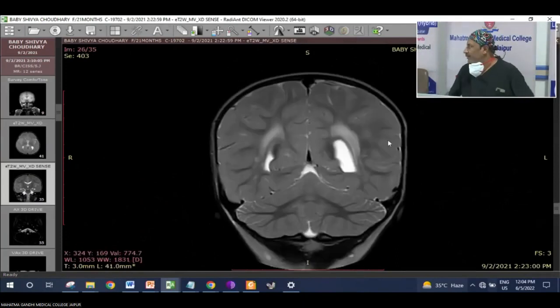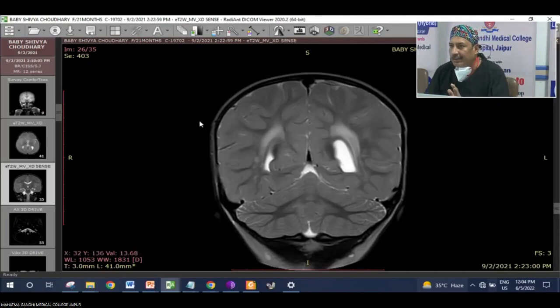Before we move on, anybody, any comment or any questions? Because this was simply how to look at CT scan and MRI from the cochlear implant perspective, not getting other information for other surgeries or anything from the temporal bone. So Kapil, Samdani sir, or anybody, sir, please. Satish, can I add something?